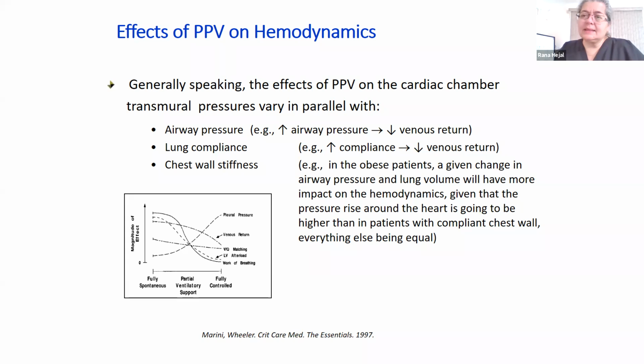Now, again, the low tidal volume strategy is the right thing. What's the value of the low tidal volume ventilator strategy? It depends on the physiology of the patient. You guys know where the 6 cc's per kilogram came from?